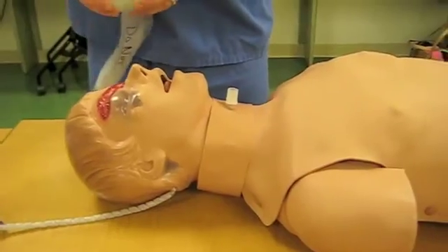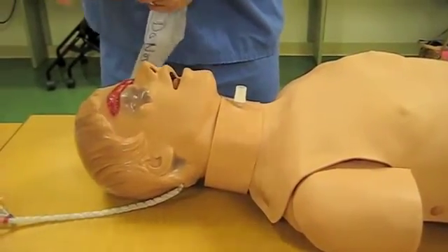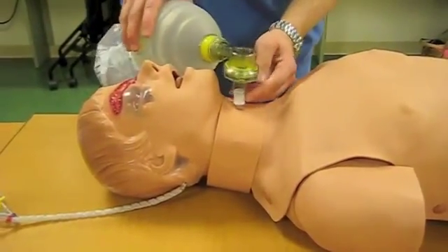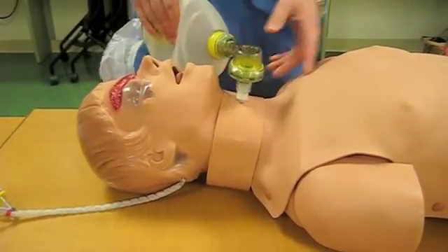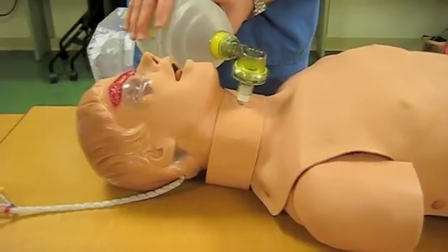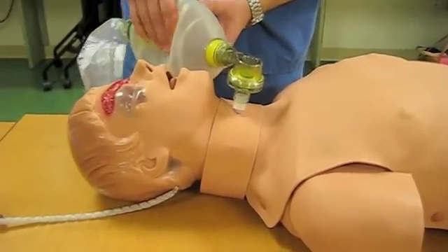To further confirm placement, like we just did with direct visualization, but like in real life, you can connect this up and you see chest rise, and so that's confirming placement.